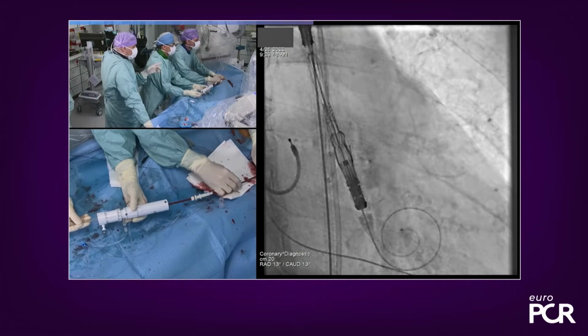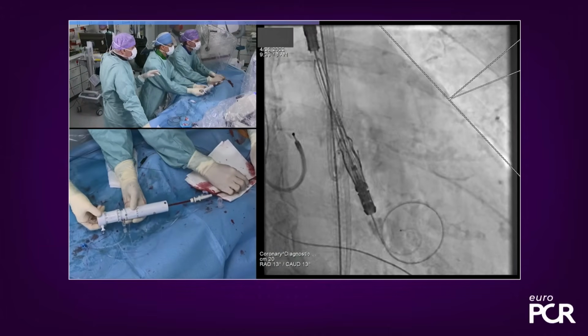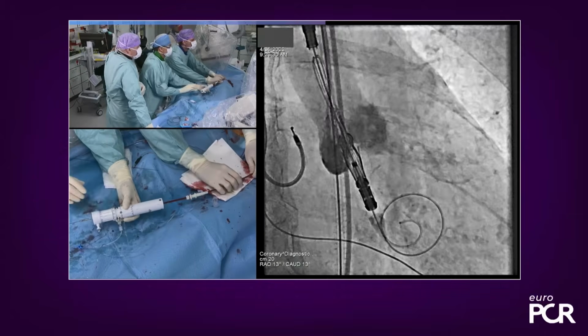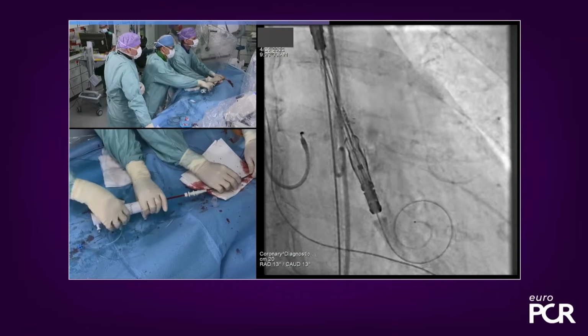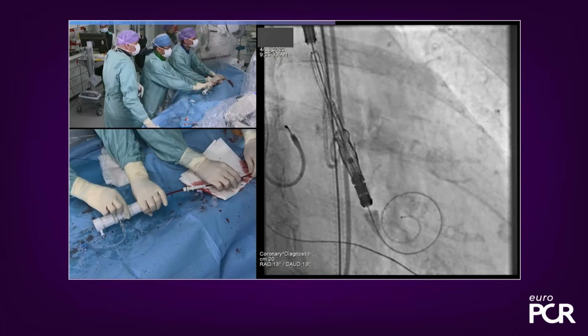So I think if you're happy about that, Ole is now going to cross the valve. Again, you see that radiopaque marker in the stent frame, that needs to be at the annulus level, at the bottom of the pigtail. We can just confirm on angiography that the pigtail is in a nice position. It is. So, yes. Gintas, you take the knob number one, and go counterclockwise slowly.